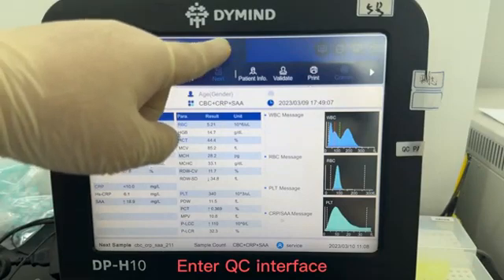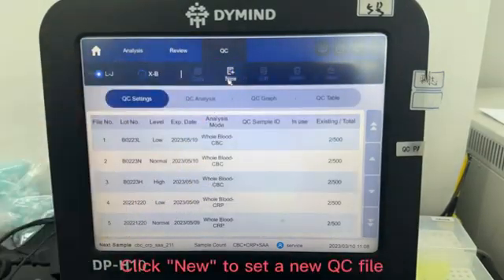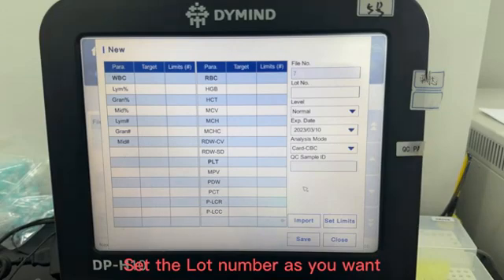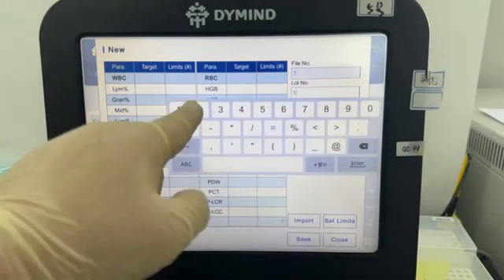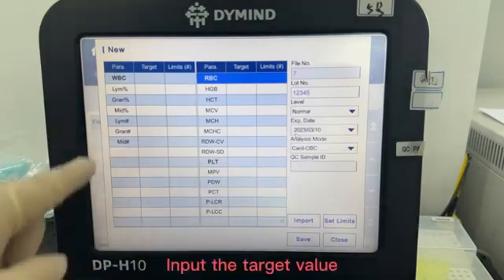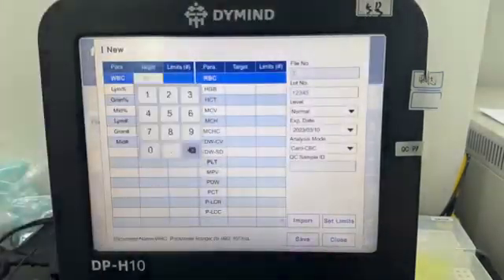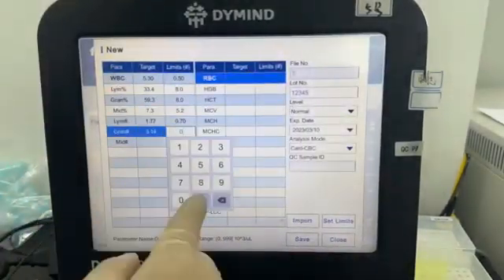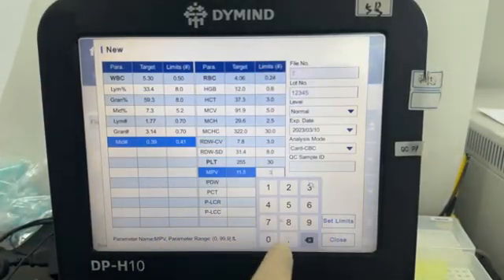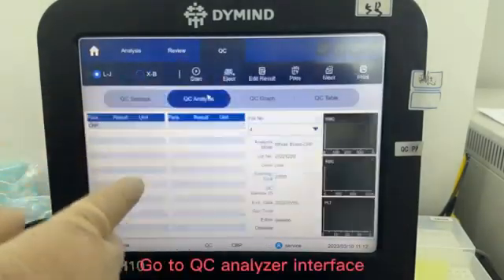Enter the QC interface. Click QC setting, click New to set a new QC file. Select card CBC, set the lot number as you want. Select the level to normal and input the target value. Click Save and go to the QC analyzer interface.